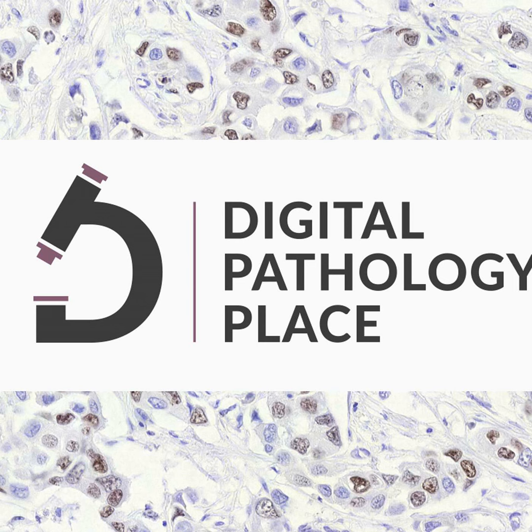You might be able to, but the enterprise imaging approach to using a standardized solution and a centralized platform for all images in the hospital provides enormous benefits in terms of economies of scale and simplicity of management, as well as allowing pathology images mixed with radiology images and images from other specialties, dermatology, dermoscopy images, and so on, OCT images. So the dermatopathologist will be able to see their dermoscopy images side by side with their whole slide images and their gross images and their immunohistochemistry images, all using the same technology, essentially.